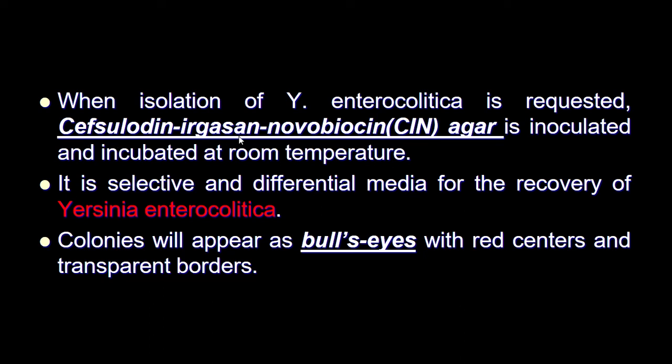Mainly we use second and third generation cephalosporins, like for example cefsulodin, irgasan, and novobiocin, we call it CIN. This is to get rid of the normal flora in the stool agar. And then we incubate that at room temperature usually. So we will isolate the pathogens, and the rest of the normal flora usually is inhibited by these antibiotics.